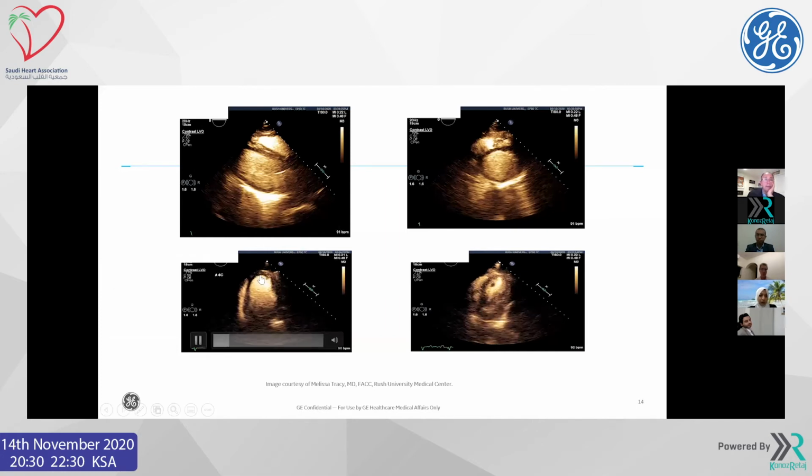Is this suspicious for an LV thrombus, just because we're not doing it a little bit lower down? So are we taking part of the epicardium or no? Because this one on the right side down looks very clear, thrombus-like. Correct. And I think when we use these agents, it certainly clarifies the endocardial border very nicely so we can see what's going on.